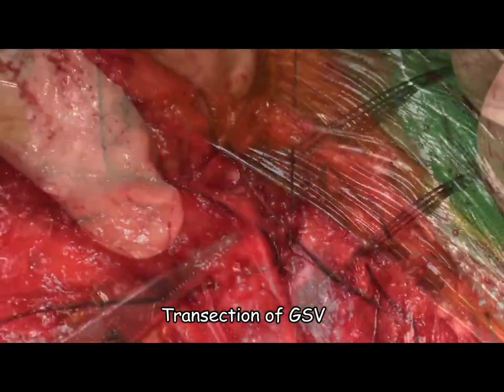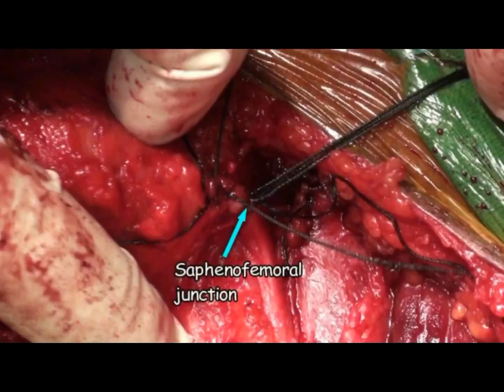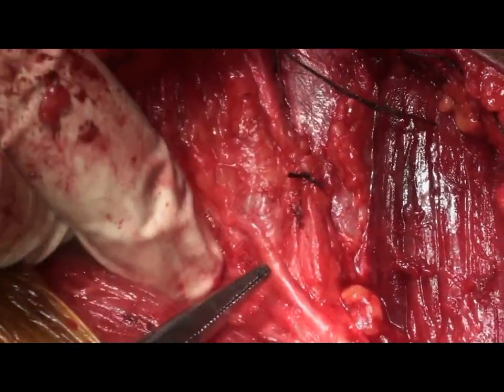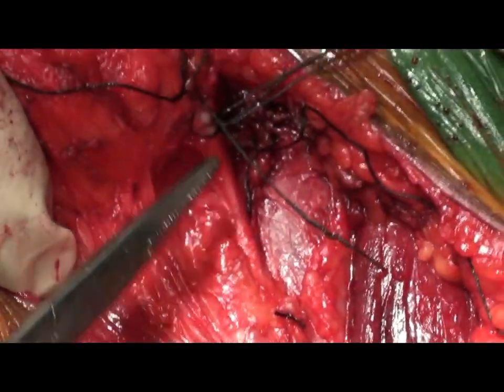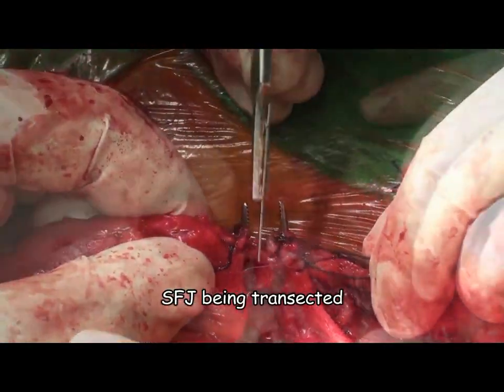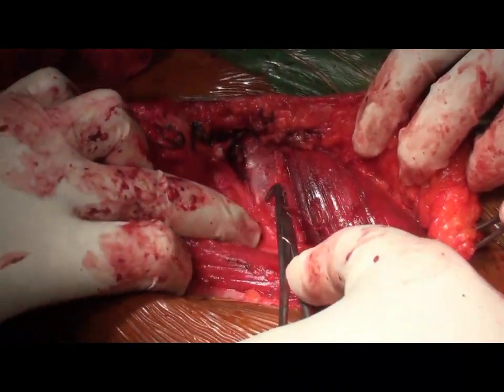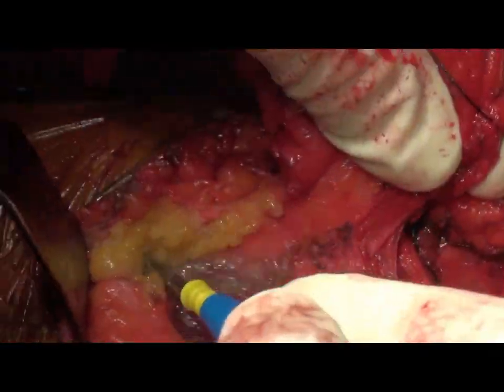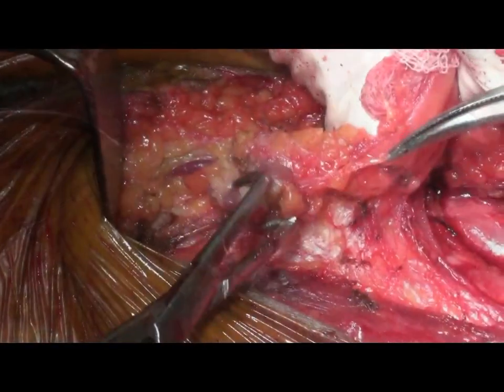The great saphenous vein hook is traced right down to its entry into the femoral vein. At this junction it is transected flush after ligating all its tributaries. The junction can be very clearly seen: femoral nerve, femoral artery, femoral vein from lateral to medial. The empty space and the lymph node of Cloquet — already taken — are noted. The saphenofemoral junction and the great saphenous vein are transected. The boundaries are revisited: adductor longus and sartorius are nicely seen. Femoral artery pulsations can be appreciated. The lateral circumflex tributary needed to be ligated. The dissection now proceeds upwards towards the inguinal ligament until all the lymphatics — especially the superficial group — are dissected.